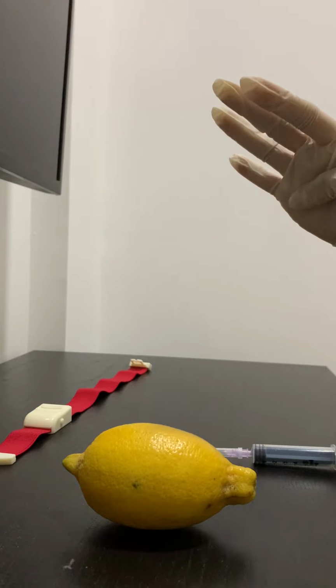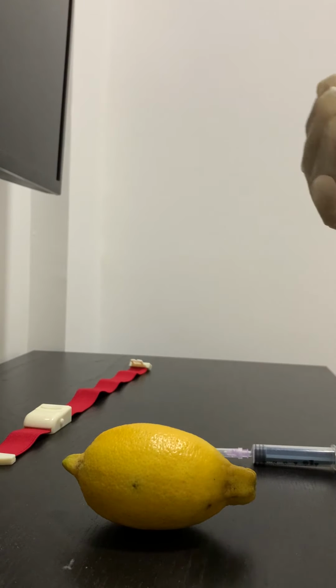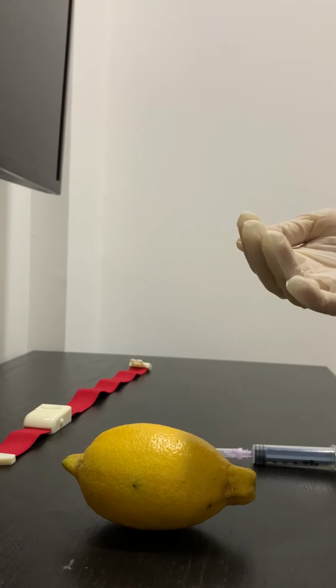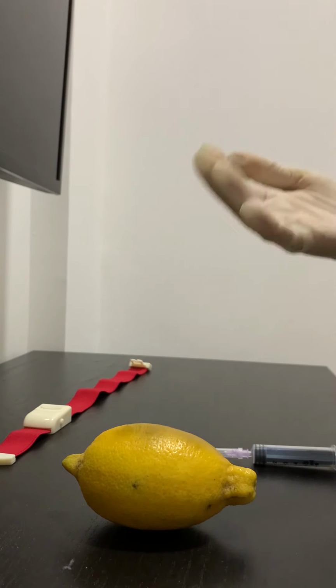There are four main types of injections, which are intradermal, subcutaneous, intramuscular, and intravenous. Today, I'll demonstrate three of these types of injections. For the preparation of injections, first we need to ask the consent of the patient. Then we need to prepare necessary materials.